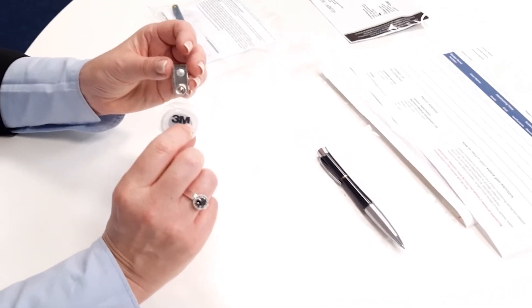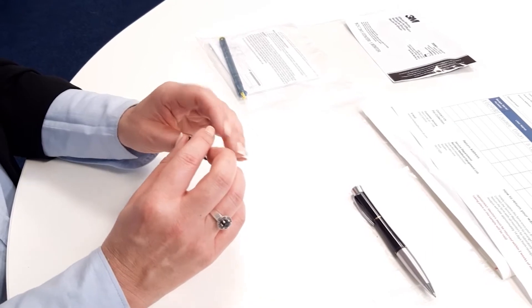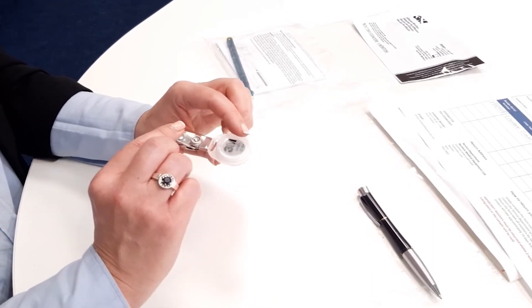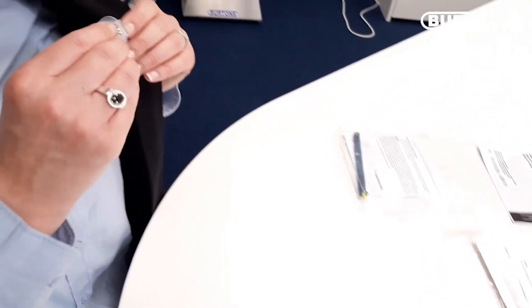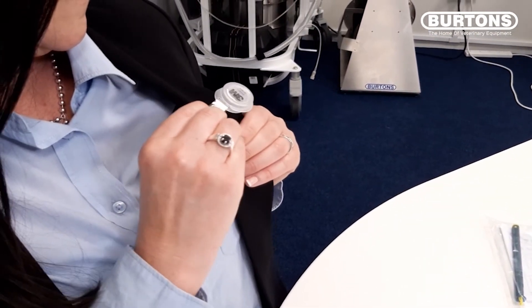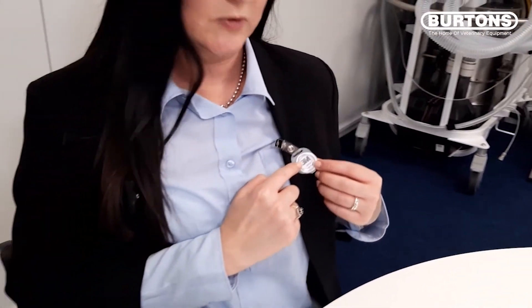For personal monitoring, the badge needs to be secured to a collar, pocket or lapel in the person's breathing zone. It should be fitted with the 3M facing out.